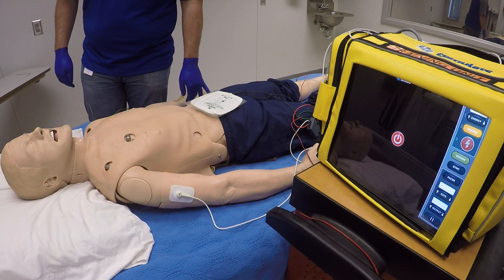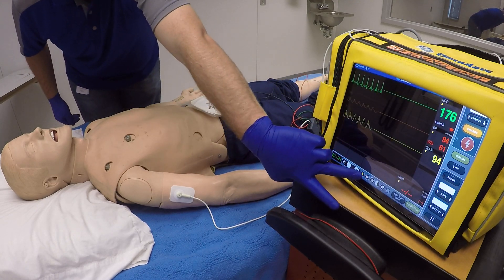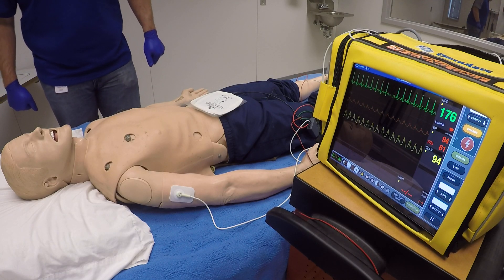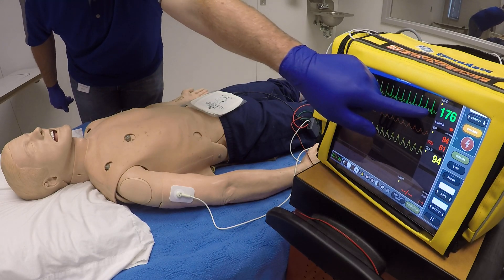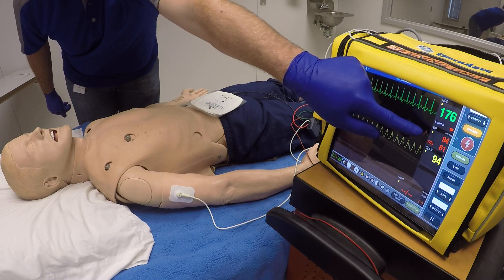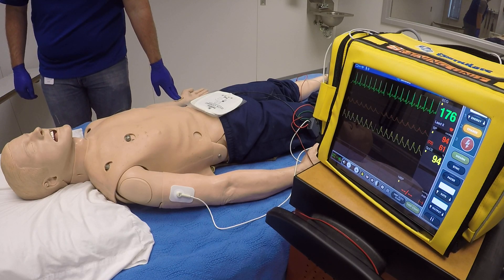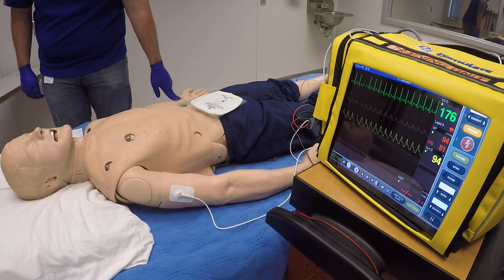We're going to go ahead and turn on our monitor and identify the rhythm that is necessary for synchronized cardioversion. We see that we do have a supraventricular tachycardia rate of about 176. Our blood pressure is 94 over 61, and our SPO2 reading is 94%. We want to assess pulses and determine their level of responsiveness, and make sure we do have a pulse.